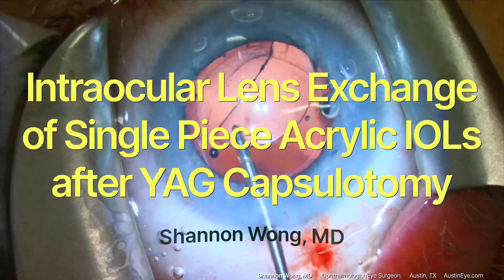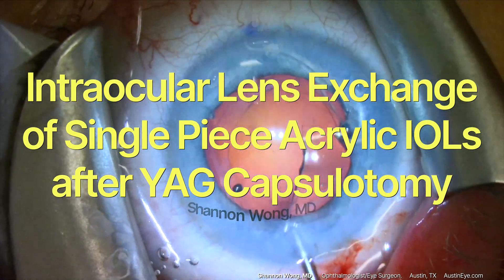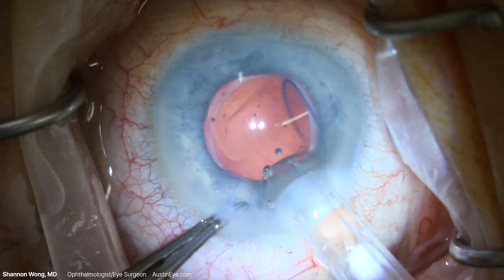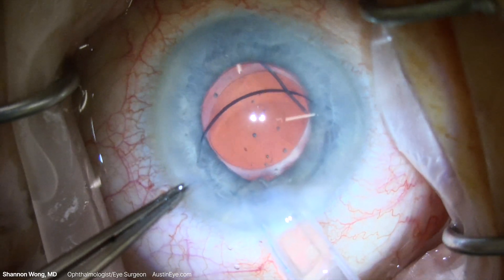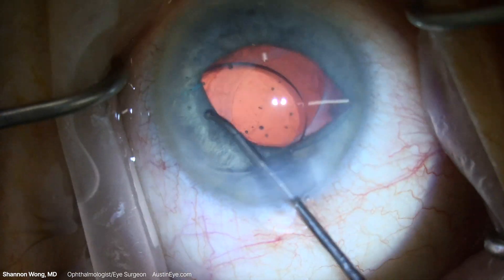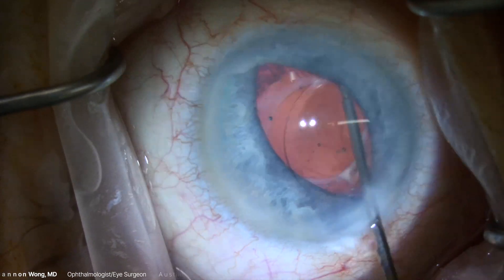Intraocular lens exchange of single-piece acrylic lenses after YAG capsulotomy. I was trained that if there's an opening in the posterior capsule, to never place a single-piece acrylic lens into the eye — instead, place a three-piece lens. Herein lies the dichotomy between theory and reality.